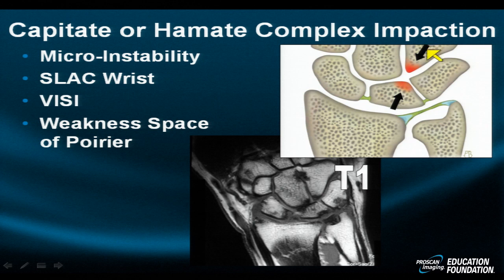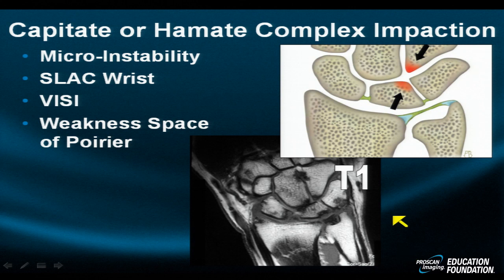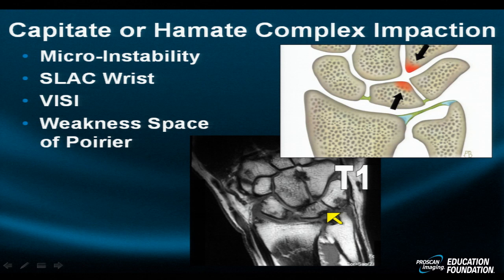An uncommon type of impingement involves the mid-carpal space, especially when the mid-carpal ligaments become lax, dissolve, or rupture. This micro-instability phenomenon leads to hamate extension proximally and palmarly against the lunate, producing erosions at the base of the hamate. The capitate can similarly migrate proximally and palmarly, also leading to erosions of it and the adjacent lunate. This patient also has an erosion along the base of the lunate from ulno-lunate abutment.